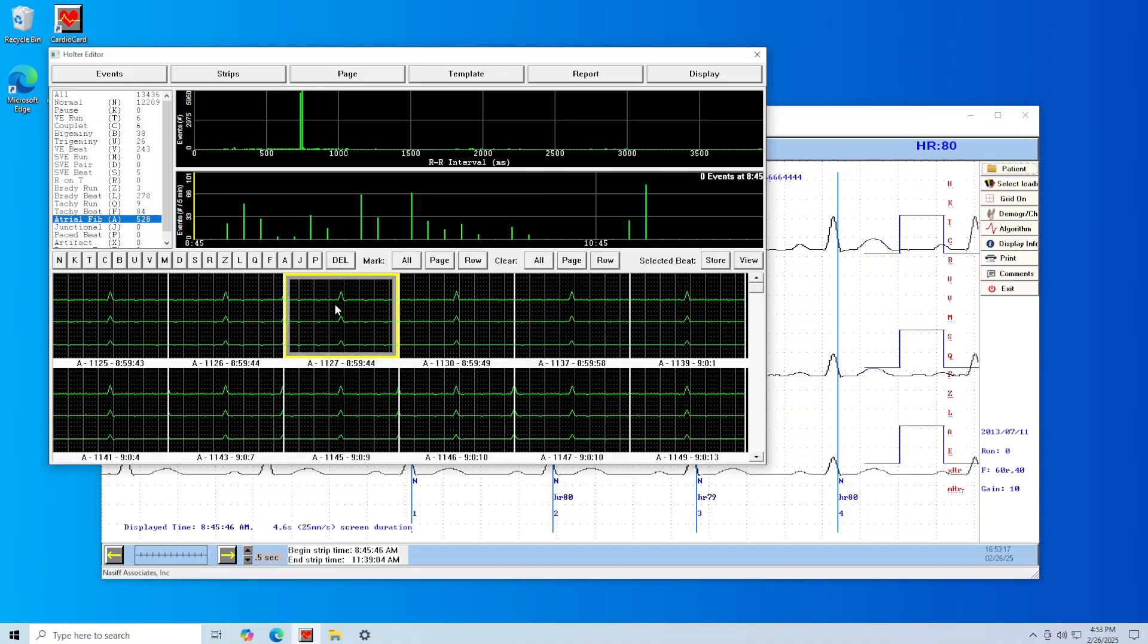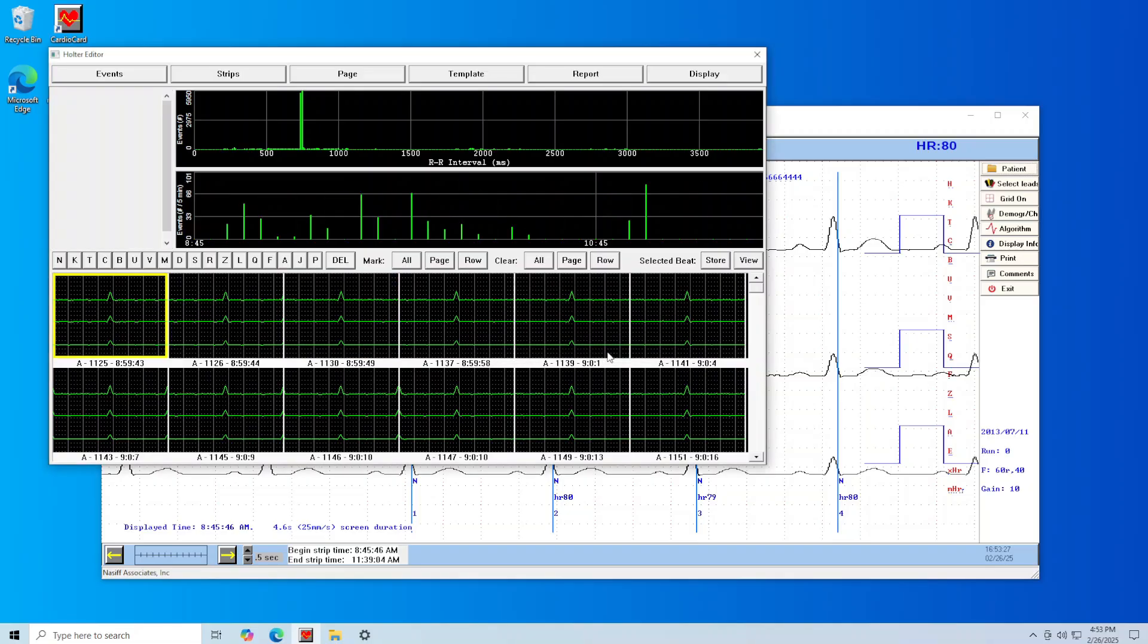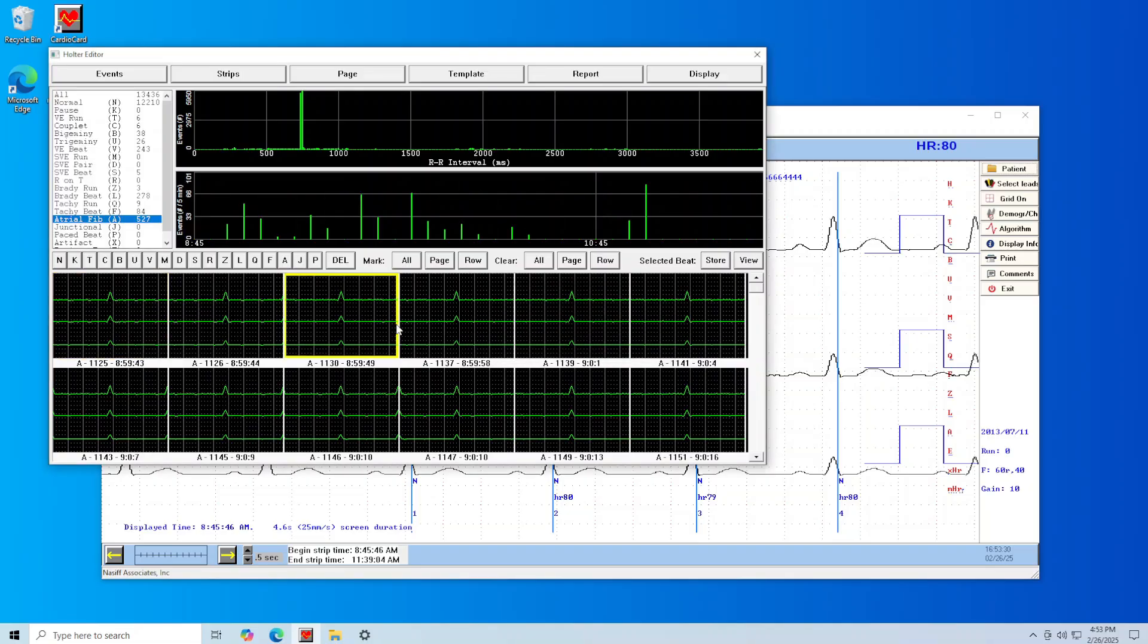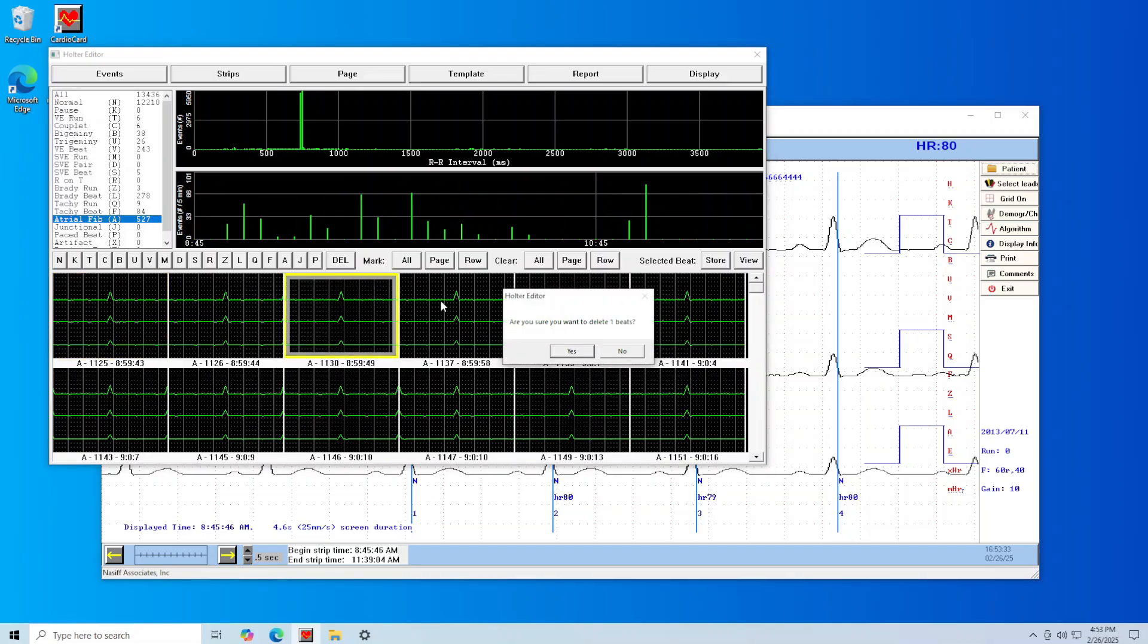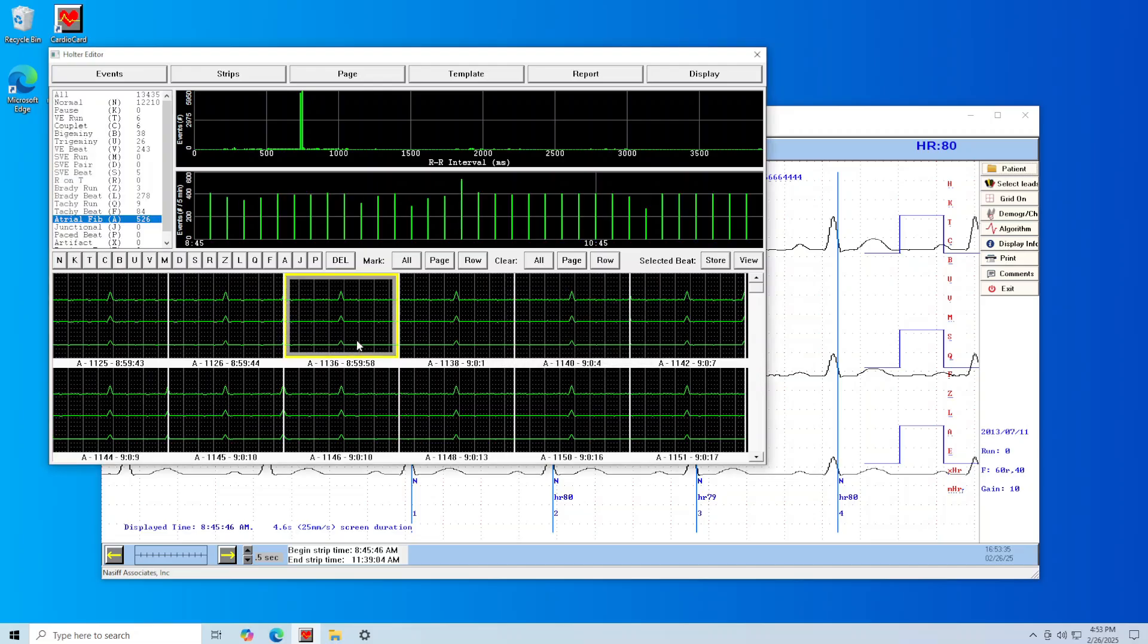Select the beat type you want to change it to. For example, selecting the N beat type marks the section as normal rhythm. You can also select Delete which will remove the selection, though you can also mark these selections as a pause to review and batch remove from your test in the future.